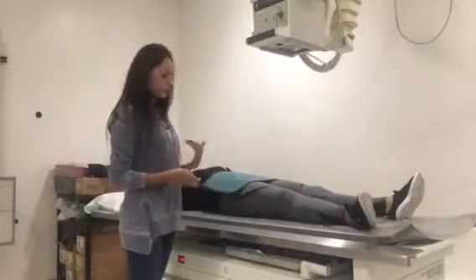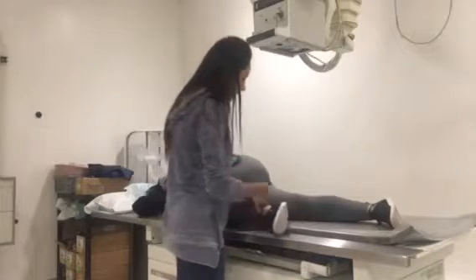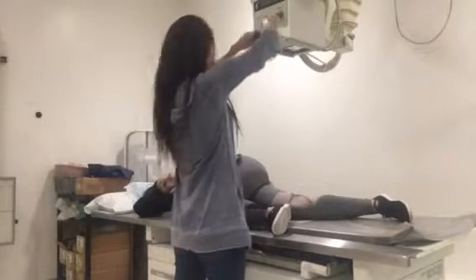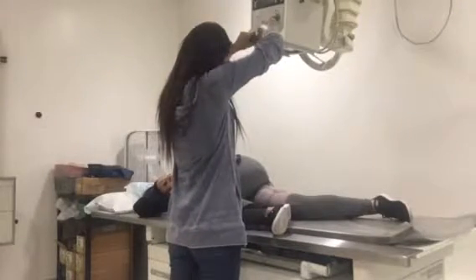Okay, so this time I would ask my patient to roll onto her right side. And so she would bring the unaffected leg over, and then she would flex her right leg 20 to 30 degrees. And at this time I would angle my tube 5 to 7 degrees cephalad.